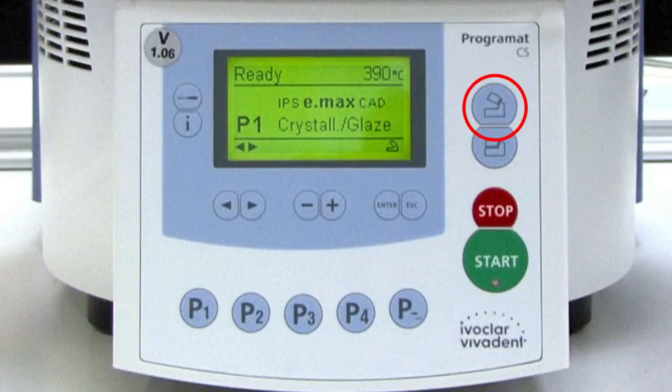The open furnace head key is used to open the furnace. Note that the furnace head will not open when a firing program is running. The close furnace head key is used to close the furnace. Note that the furnace head will not close when a firing program is running.